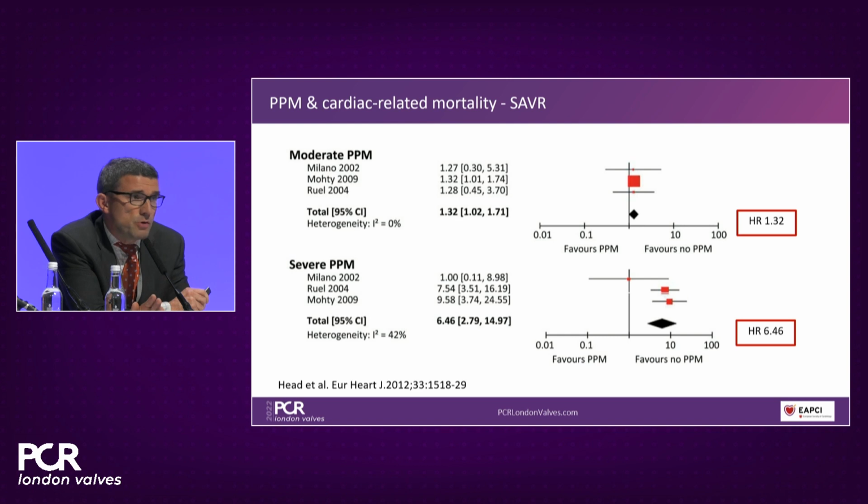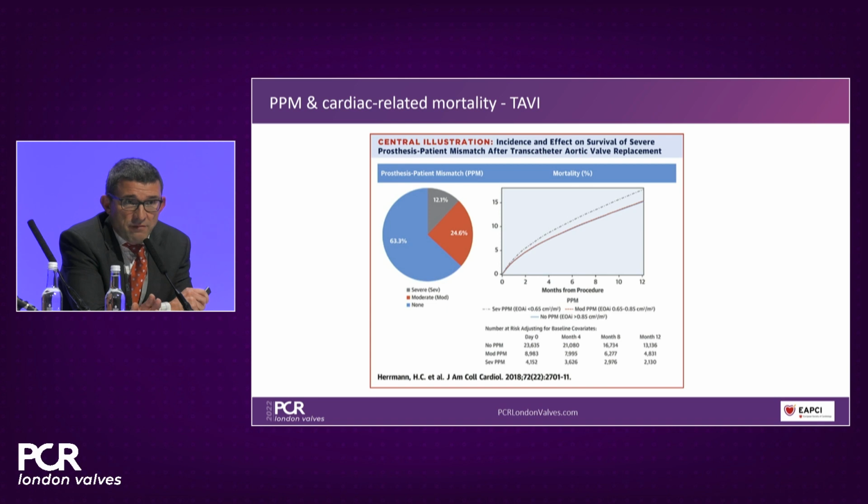That's all very well and good, you may say, but we're in a TAVI era and we're discussing TAVI in preference to SAVR in many of the cases we undertake these days. Well, here's the TAVI data. And this is from the TVT registry published 4 years ago.